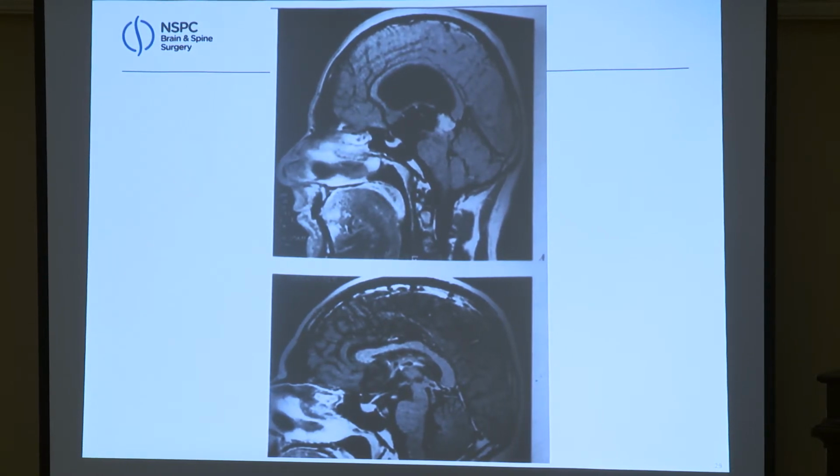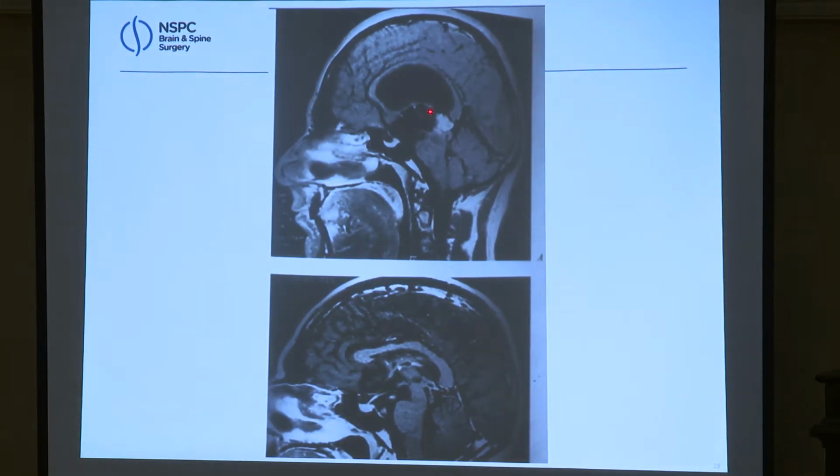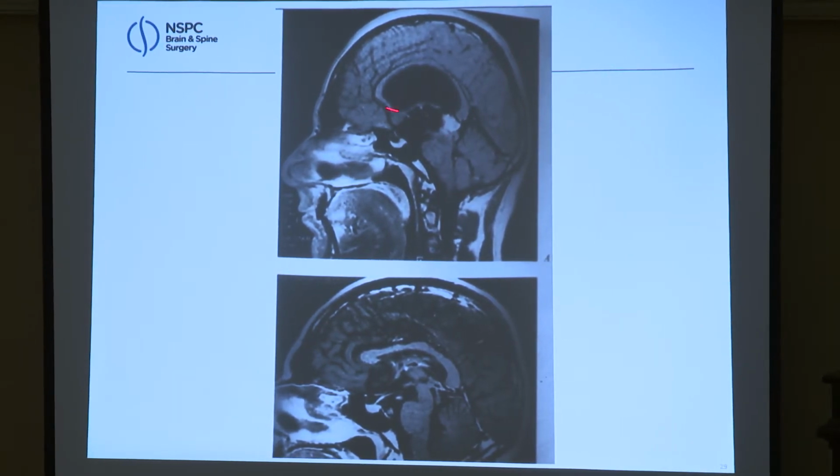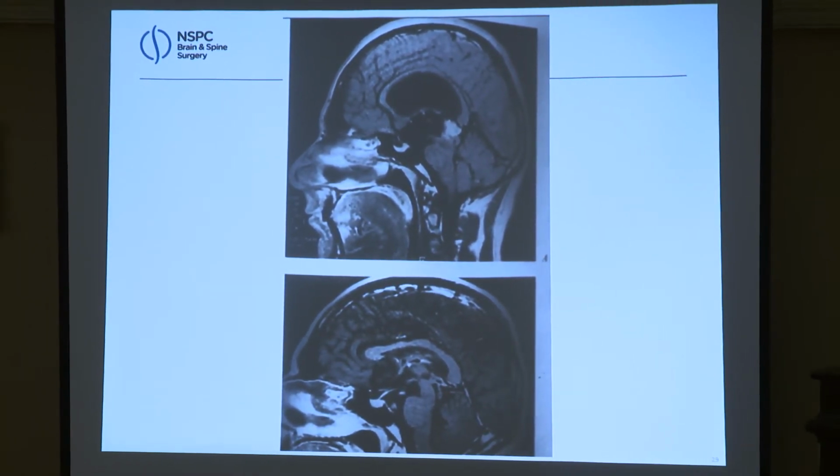This is not my case, this is a Pittsburgh case, but someone who had a benign pineal tumor. I don't even think they biopsied it, but again, they felt based on markers, everything was benign tumor. It would have been complicated to remove. They did Gamma Knife, and lo and behold, it disappeared.